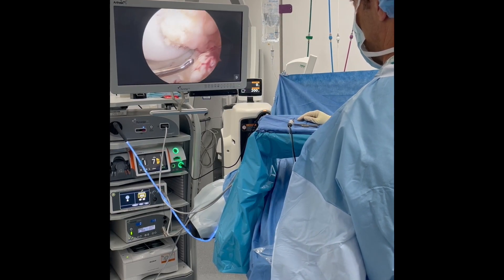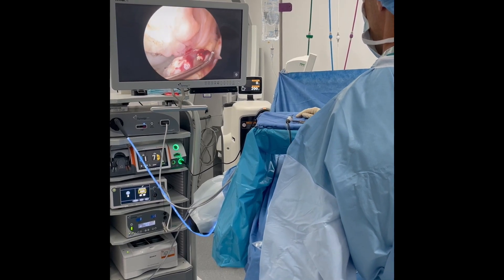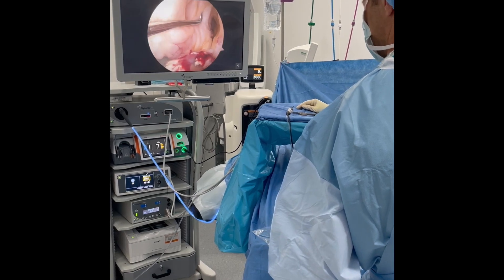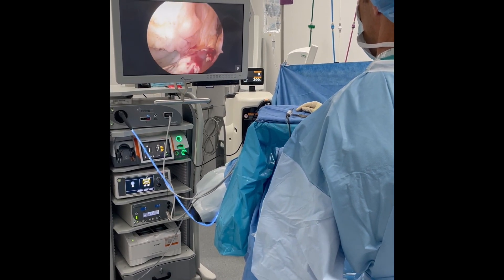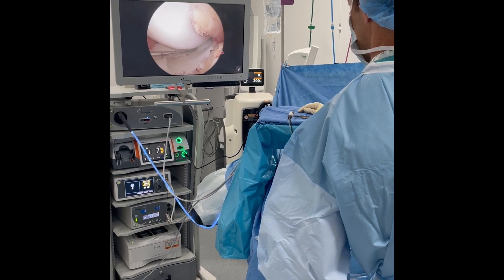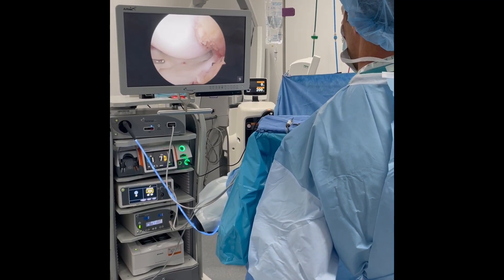She also has a ruptured ACL here. The remaining fibers are very vertical, which results in rotational instability — it really should be inserted over here. So we'll reconstruct her ACL and sew the meniscus back with circumferential compression stitches so it stays in position and heals.